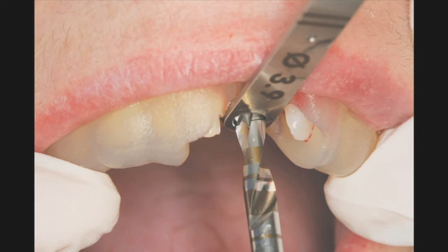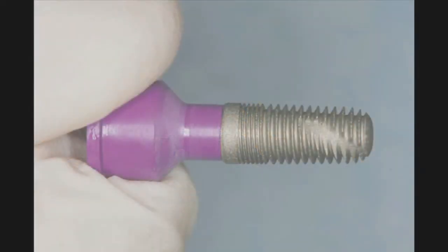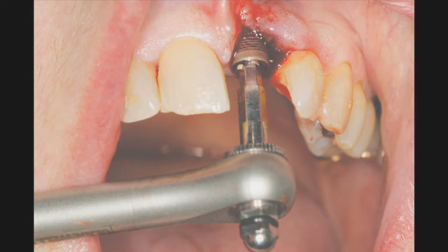Again, angulation was virtually determined using the CT scanning software. We know the depth that we're going to, we know the position we're going to, and we also know the final width that we're going to go into. The Glidewell implant is carried to the site and positioned and torqued to approximately 35 Newton centimeters, so we did get good torque. It is important to finish seating with one of the internal hex flats to the facial, matching the orientation of the model as closely as possible. It will give you the best final aesthetic result.